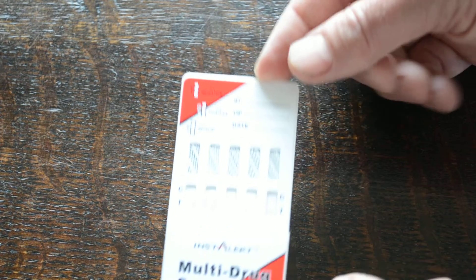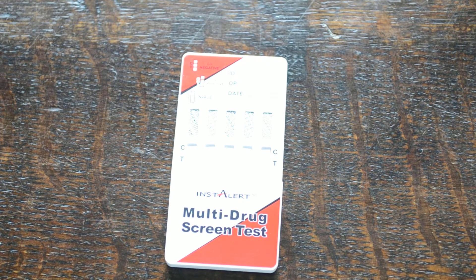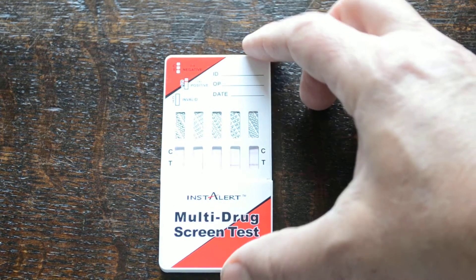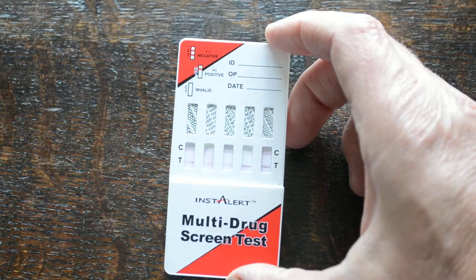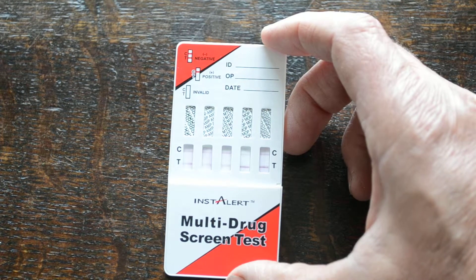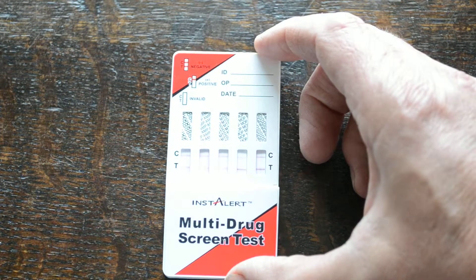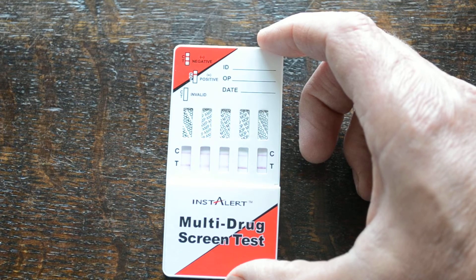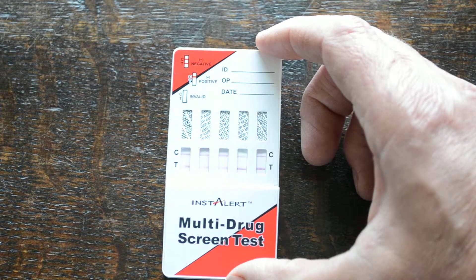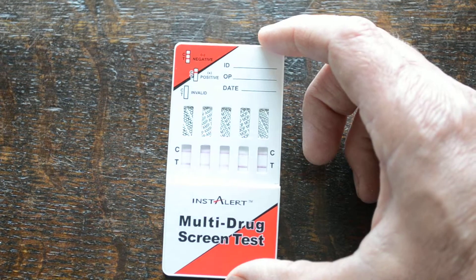The panel can be resheathed, placed on a dry non-absorbent surface, and you will see the development of the test lines and the control lines. Both are clearly marked on this panel for the area where they will develop. You'll see at this stage already negative test lines developing on most of those membranes, and the control lines — now even at 45 seconds — are all showing.